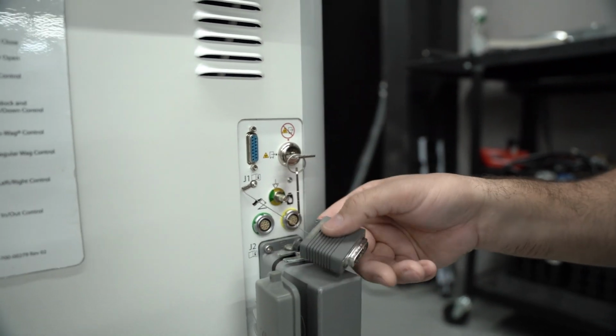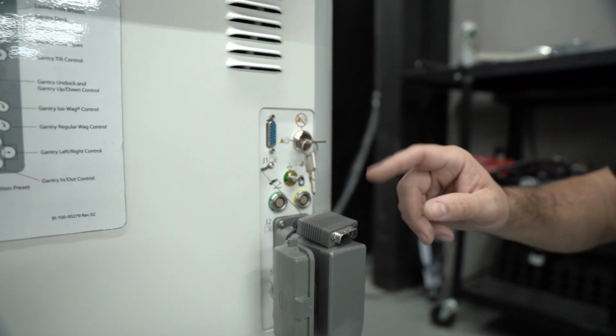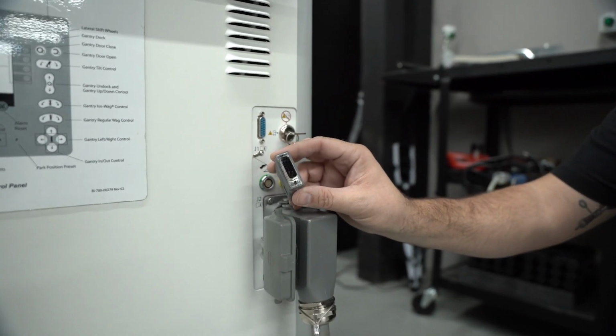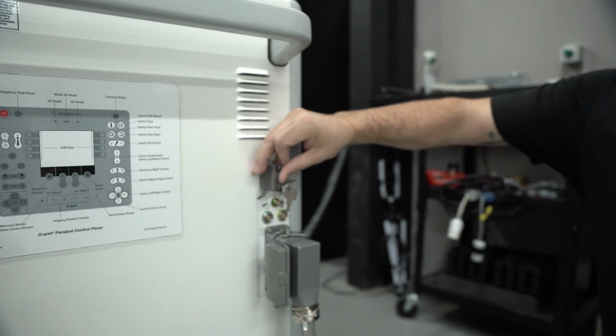If you come down here, you have a pendant jumper, and as you can see, it was barely plugged in. It had come loose. This port is for connecting an external pendant. It's very rarely used, and when it's not used, this jumper has to be plugged in securely in order for the E-stop circuit to function the way it's supposed to. Simply plug it in, secure it with the set screws.